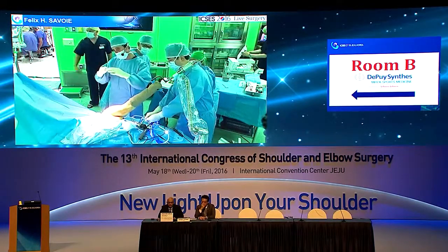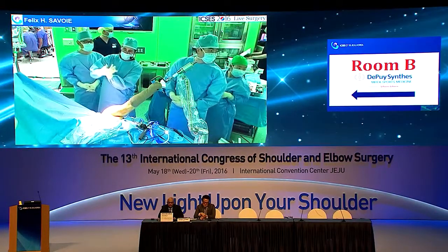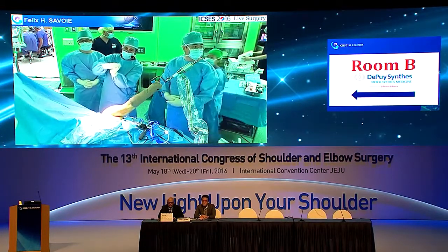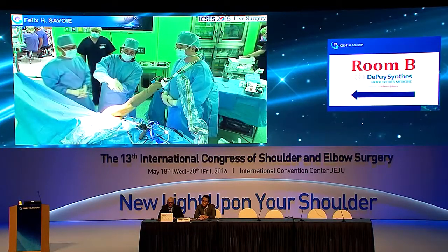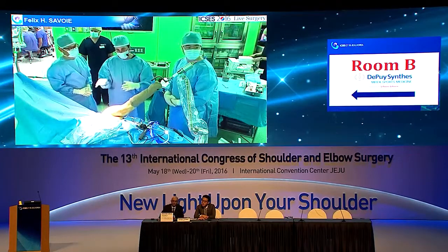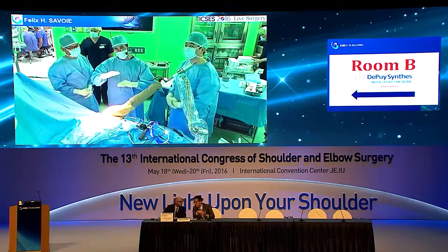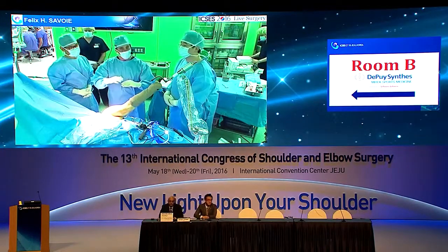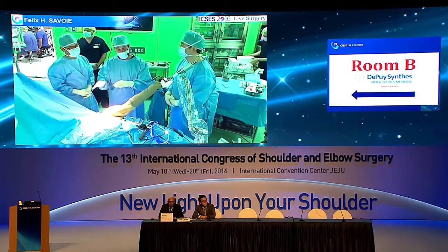When you look at undersurface parts like this, the capsule is still attached to the underside of the tendon. So that goes back like this, so that the capsule is attached and then the footprint is restored. If you have no capsule and the head is not up and everything is balanced, you don't have to worry about it. But if the head is up and you have a narrow acromial-humeral distance, then you may need to do an inferior capsular release. You may need to bring it down. And then if you have good tendon and muscle and the capsule is still on the tendon, then you can put it all back.